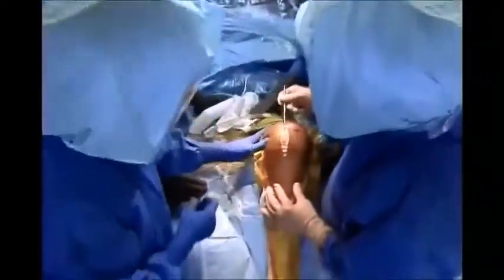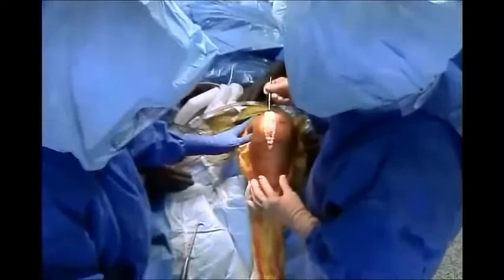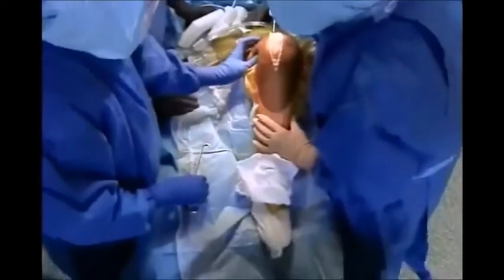I am Dr. C.S. Ranavad. I am demonstrating surgical technique for correction of a valgus deformity.